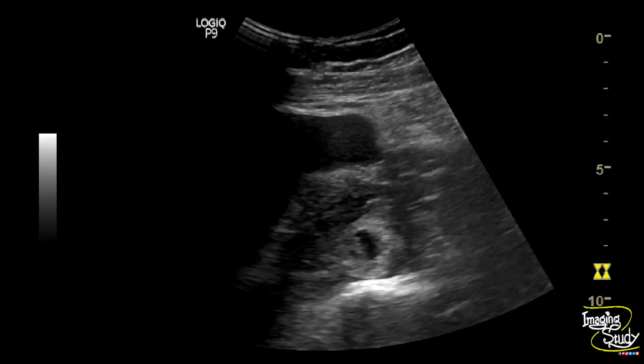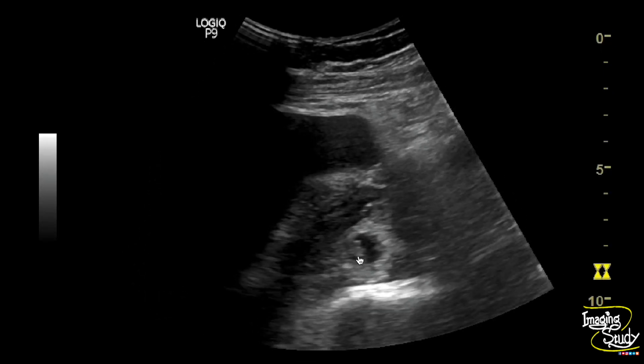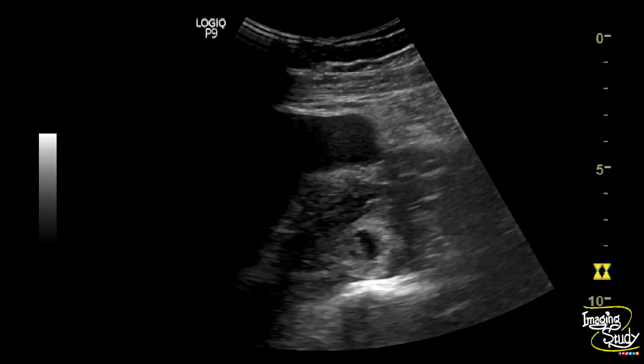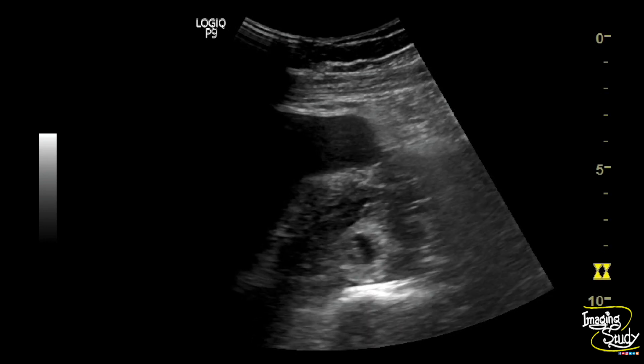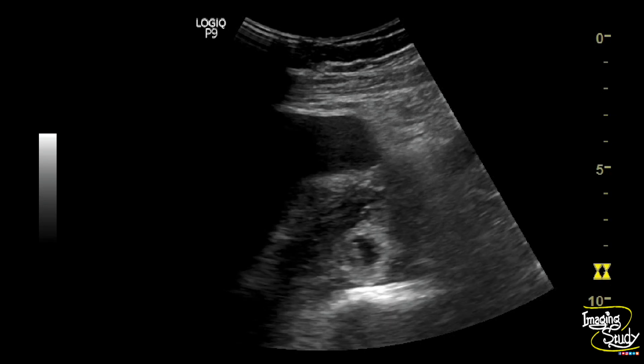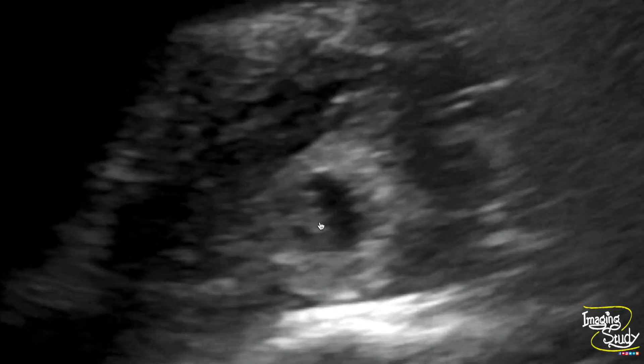Here is the embryo, and you can see the cardiac pulsation indicating live ectopic pregnancy. In the magnified view, you can see the tiny embryo with internal movement — that is the cardiac pulsation — confirming it as a live ectopic pregnancy.